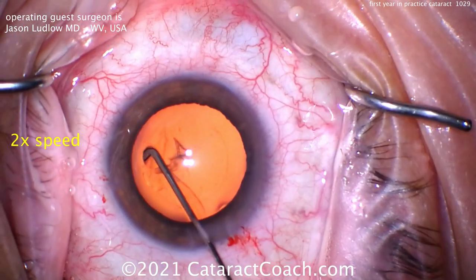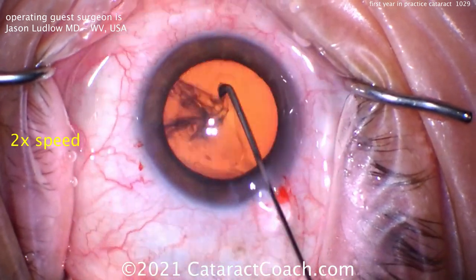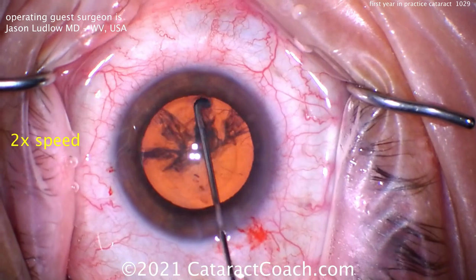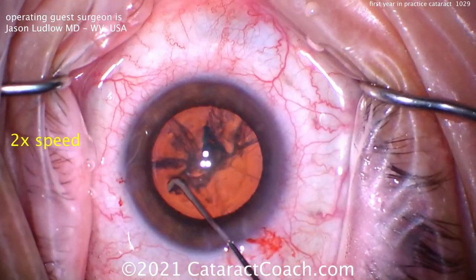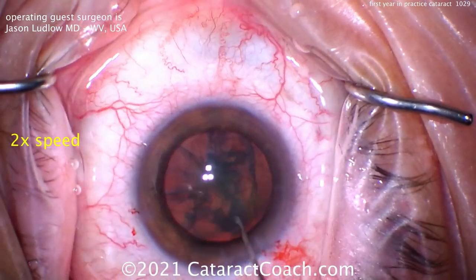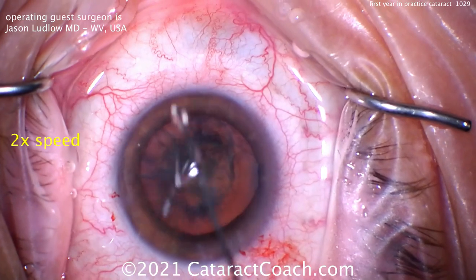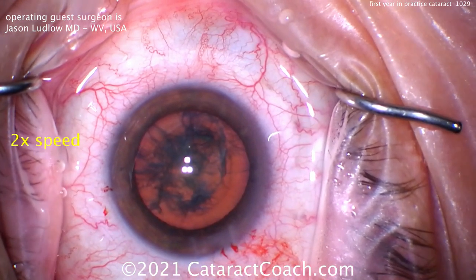Let's see the hydrodissection here. Using a specialized cannula, going to the left side first. There's a good fluid wave coming to the right — another good wave. That looks pretty good. Remember, you want to get this thing spinning. If it does not spin, you will not win. Looks pretty good. I like it.